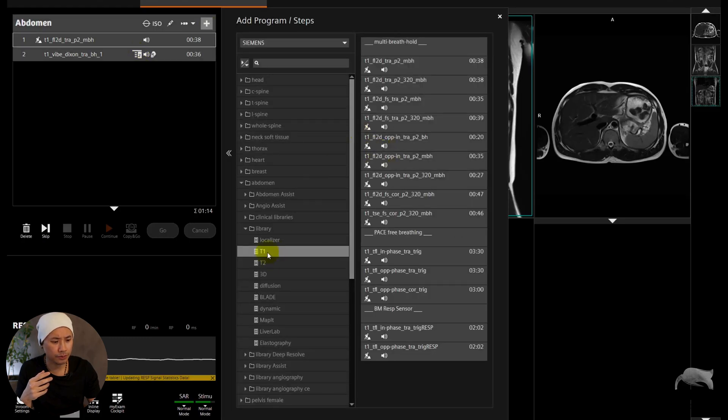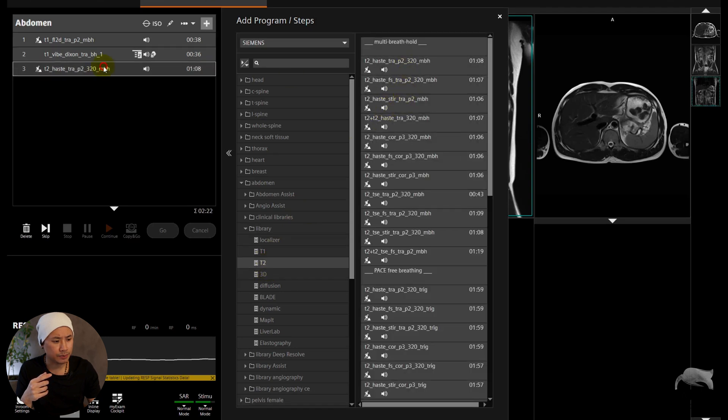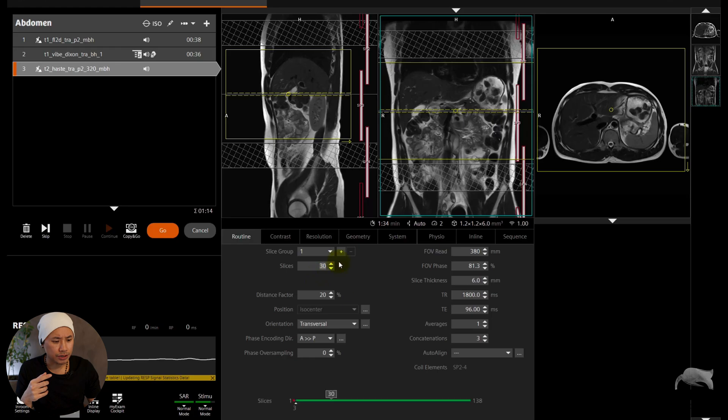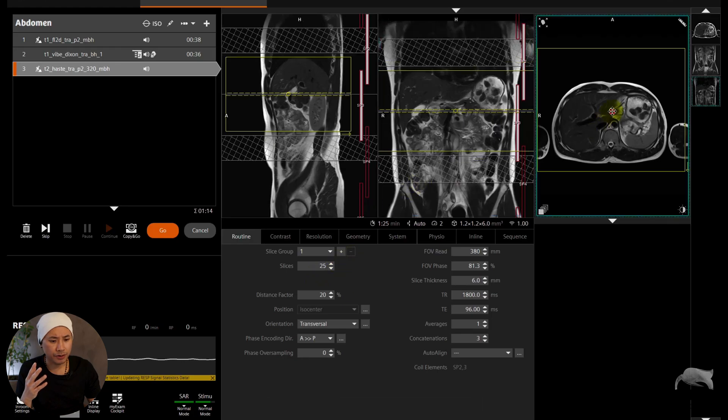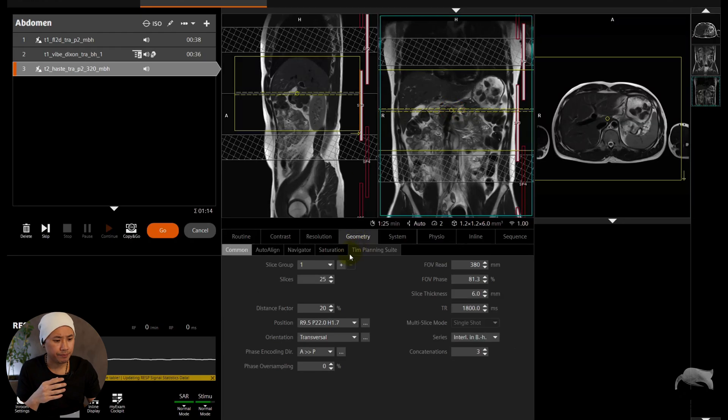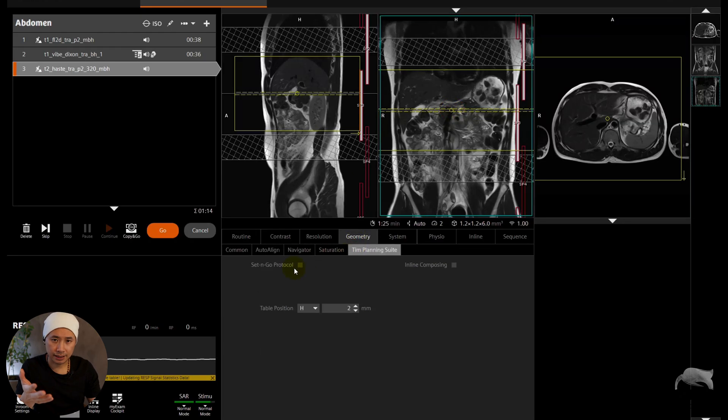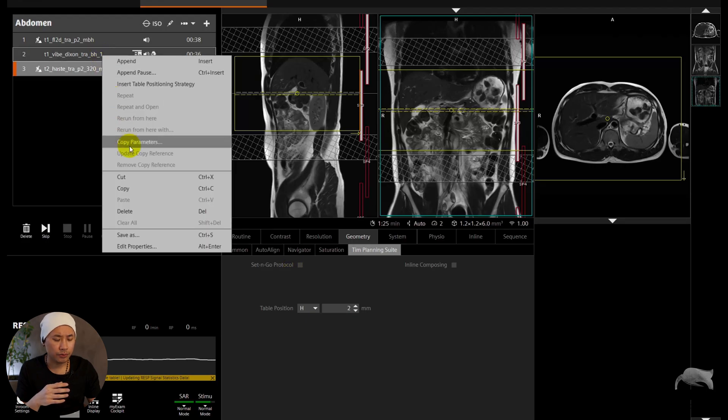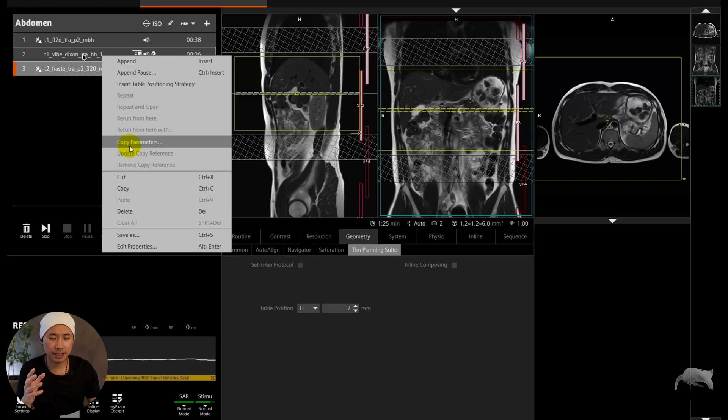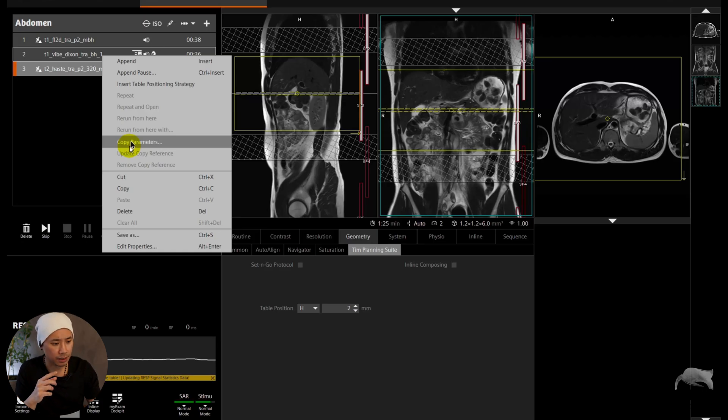We go to T2, we find a T2 HASTE like this. It's a multi-breathhold. So let's just try to cover the liver part first, just around 25 slices like this. And then Geometry, Tim Planning, and then Set and Go. No, we don't need to push Set and Go, it just takes time. What you're going to do now, you right-click on your VIBE, your sequence which was your first coverage, you take Copy. Right-click, Copy Parameters.